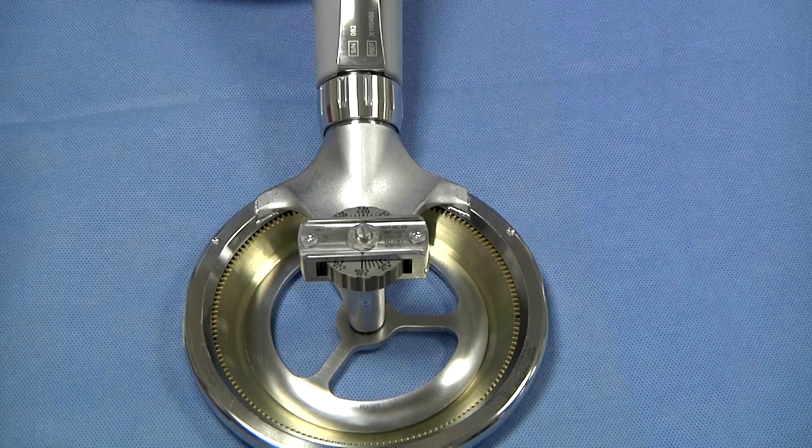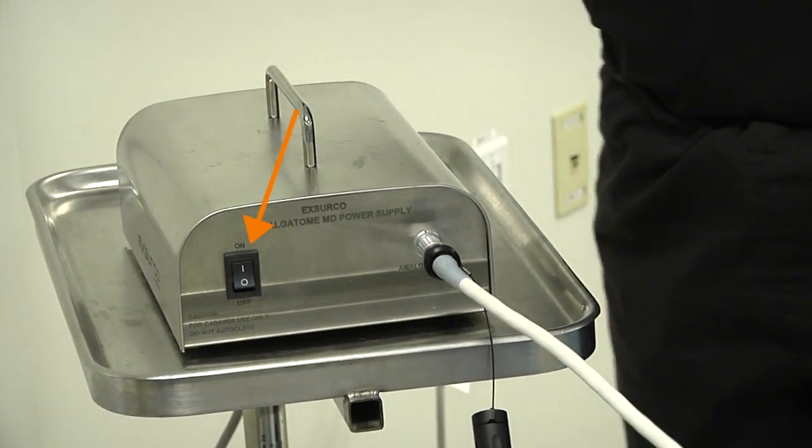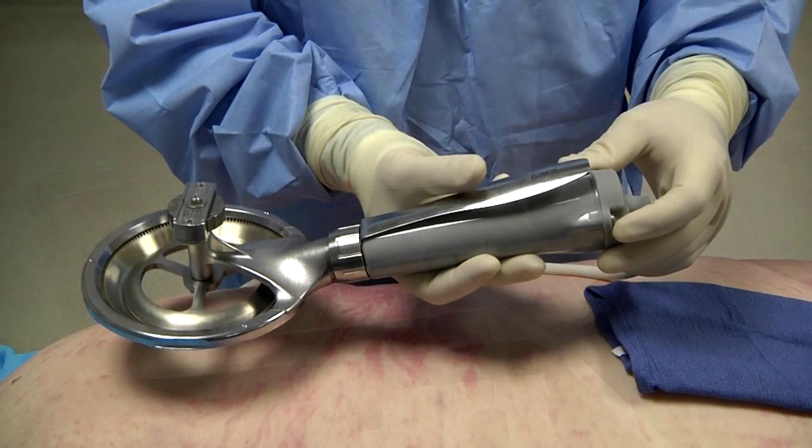Once the sterile operator has installed the blade and is ready to turn the power on, turn the power supply switch to the on position. The Amalgatome MD skin recovery device is now ready for use.